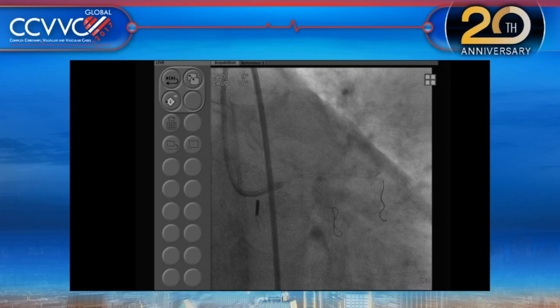Yeah. It looks like that new wire didn't do much better. All right, I think we'll try again. I think Kinney didn't like the wire. I know. The next one, I'll do it. When you don't hear any comments from me, that's it.